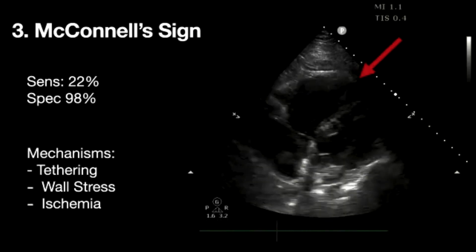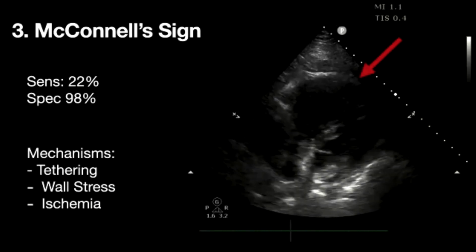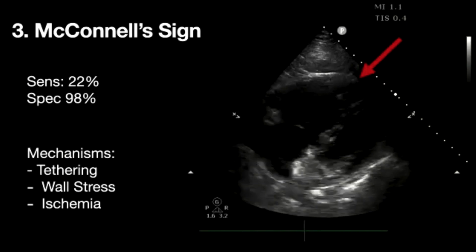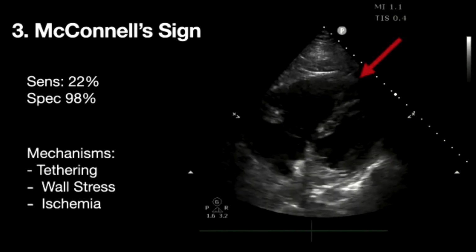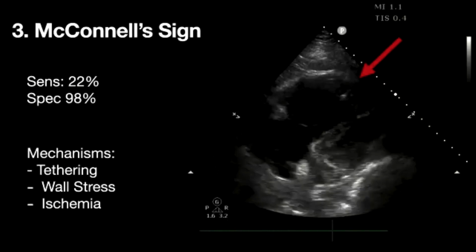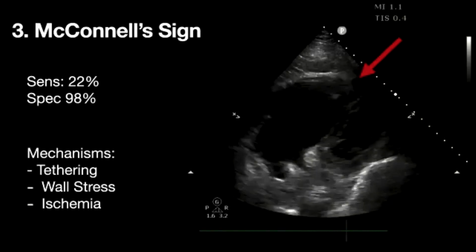You showed the short axis view more at the mid left ventricular level, in which you have the septal flattening and the bulging of the septum into the left ventricle if there's both pressure and volume overload. Even that view is pretty helpful as far as the assessment of RV size is concerned. The apical view can be tricky in terms of assessing right ventricular size. The traditional four-chamber view that is acquired at the apex can sometimes underestimate right ventricular size.